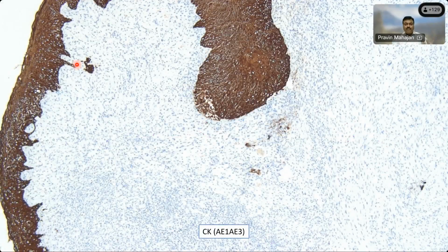But if you still want to do markers and see what is happening with them, you will be surprised that in this tumor the cytokeratin was negative. This cytokeratin here is just a blush in the subepithelium. Surface epithelium is nicely cytokeratin AE1/AE3 positive, but the tumor cells are negative. There were some other areas that were completely negative for cytokeratin. So you are surprised that even though there is dysplasia in the surface epithelium, there is a spindle cell proliferation below, which is malignant, and definitely arising from the surface epithelium. So it is a spindle cell carcinoma, but the cytokeratins are negative. So it can happen like that.